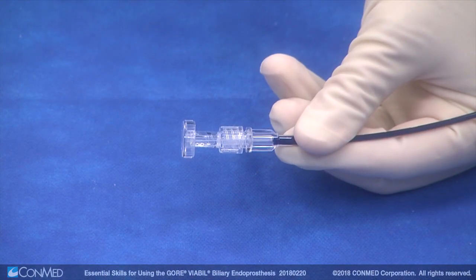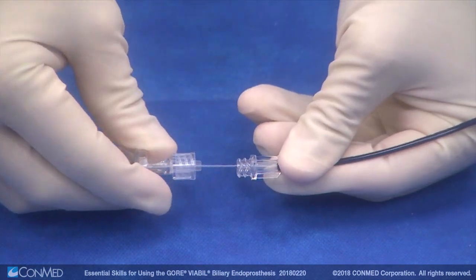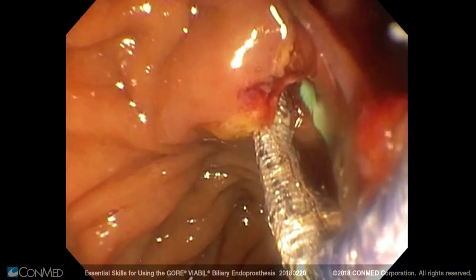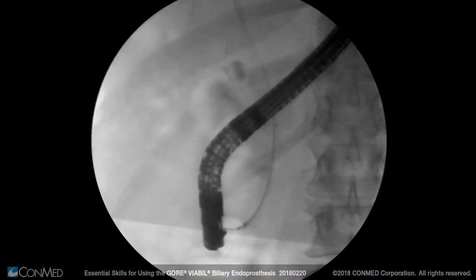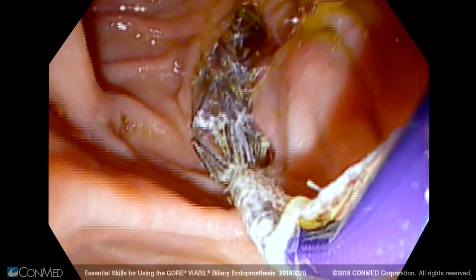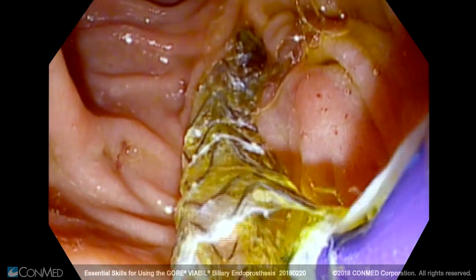When the device is positioned across the stricture, untwist the screw connector and slowly pull the deployment knob away from the hub. There is not a need to pull on the catheter during deployment. Unlike other stents, the Gore Viable eliminates repositioning associated with typical push-pull delivery. It stays true to size and does not move during deployment.